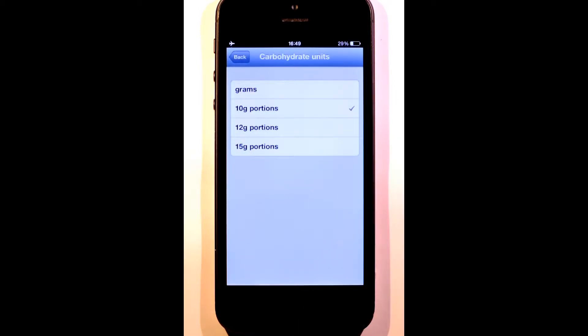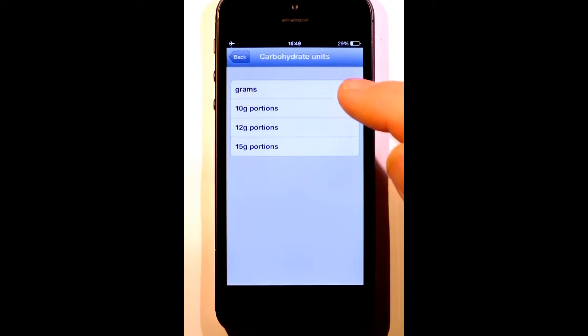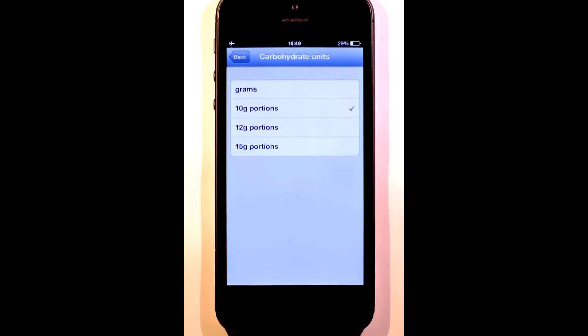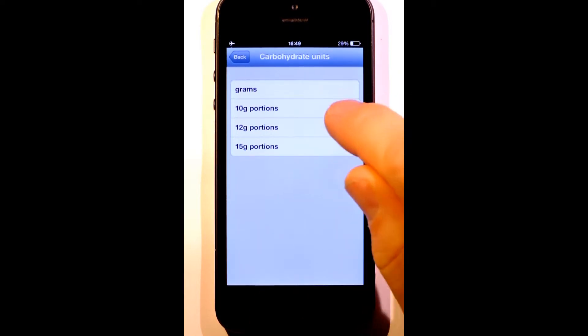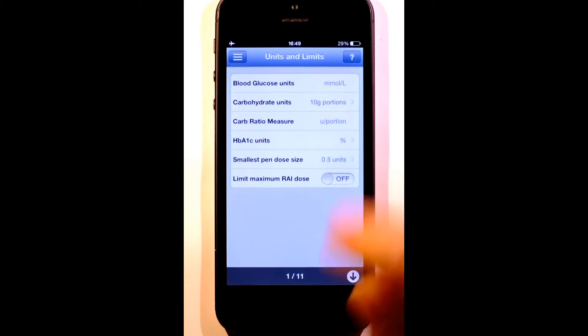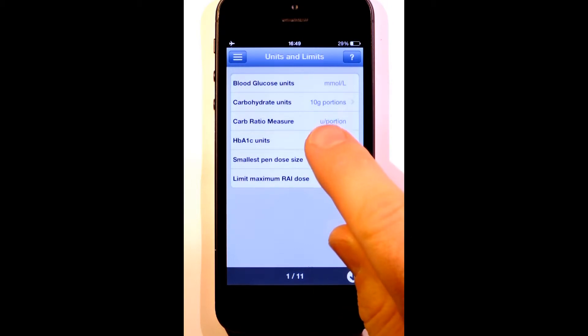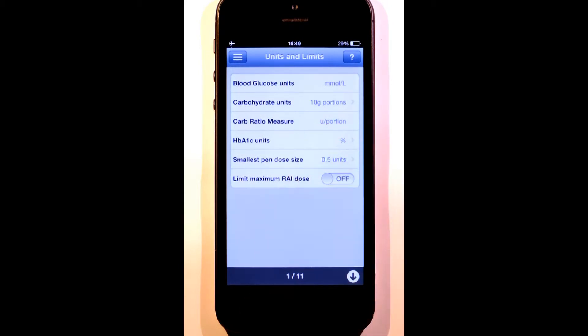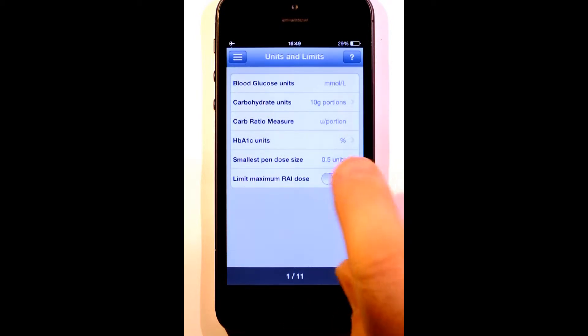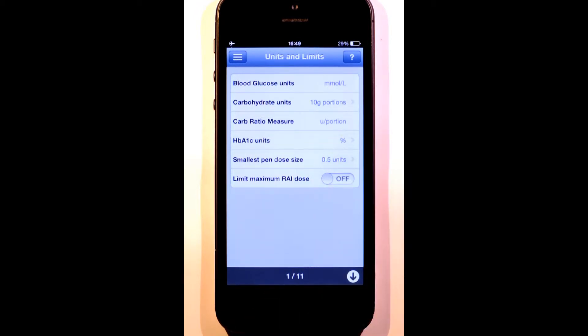RapidCalc lets you choose to measure directly in grams or in portion sizes. The carb ratio measure is auto-set by your choice of carb units. Because I'm working in 10g portions, my carb ratio measure has been set to units of insulin per portion. If I was working in grams, it would be set to the number of grams of carbohydrate covered by one unit of insulin.